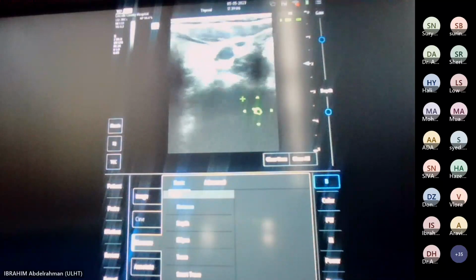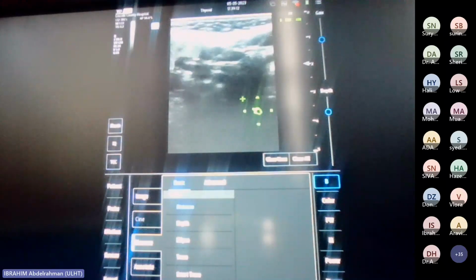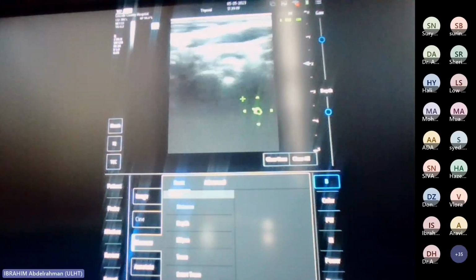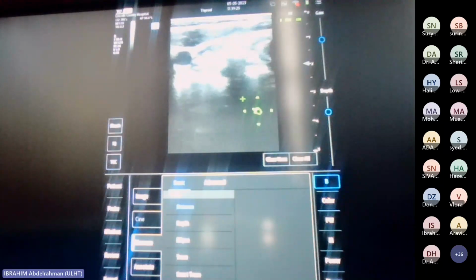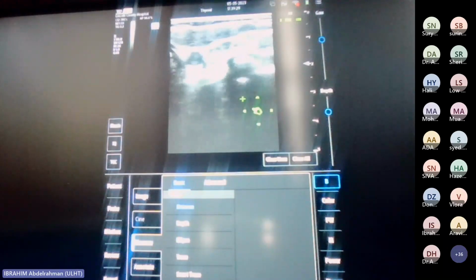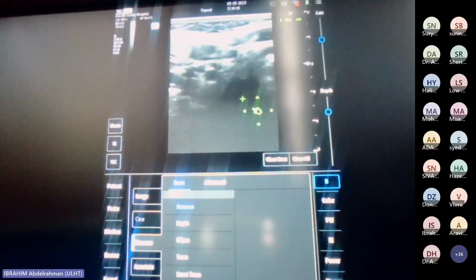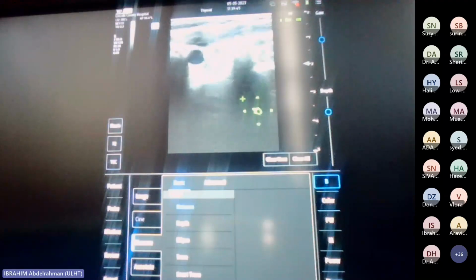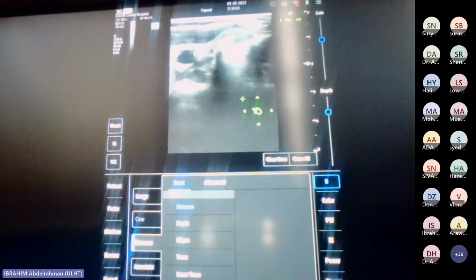So ultrasound is really useful for looking at the anatomy, and we can very easily call out normal anatomy. So long as we have an idea of pathology in the neck, we can decide whether to do a fine needle aspiration or a core biopsy when we do see pathology. So if we saw a level 2 lymph node which we thought was metastatic from squamous cell carcinoma, we would want to do a core biopsy because we would want to know the P16 status. And likewise, if we were considering lymphoma to be the diagnosis, we would also need a core biopsy because we need to be able to subtype that as well as diagnose lymphoma.